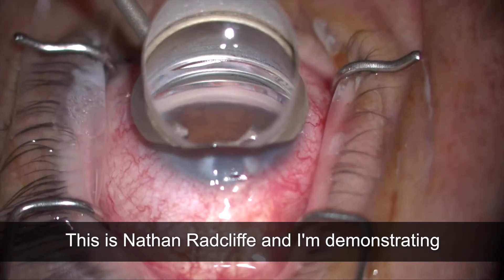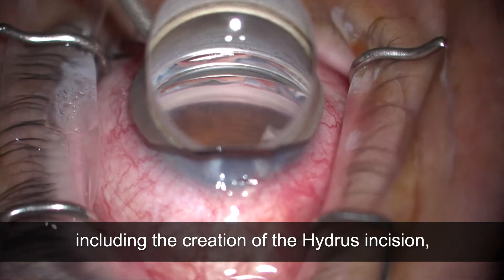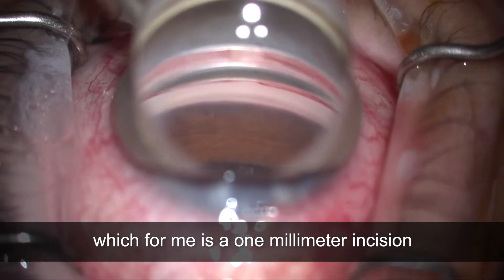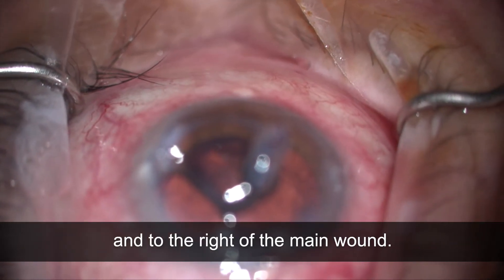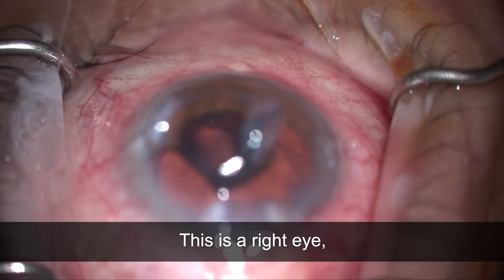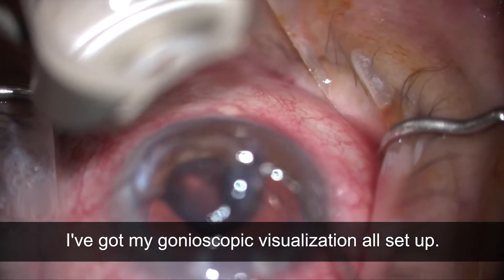This is Nathan Radcliffe demonstrating my surgical technique for the Hydrus. I've completed cataract surgery including the creation of the Hydrus incision, which for me is a one-millimeter incision parallel to my main wound and to the right of it. This is a right eye, so it's inferior to the main wound. I've got my gonioscopic visualization all set up.